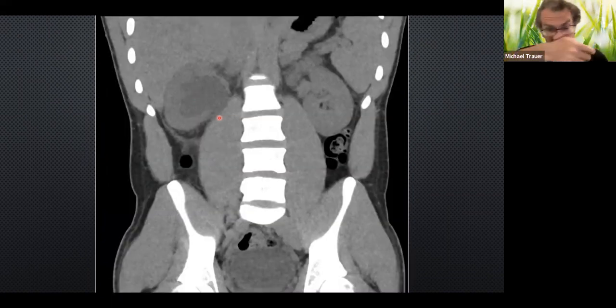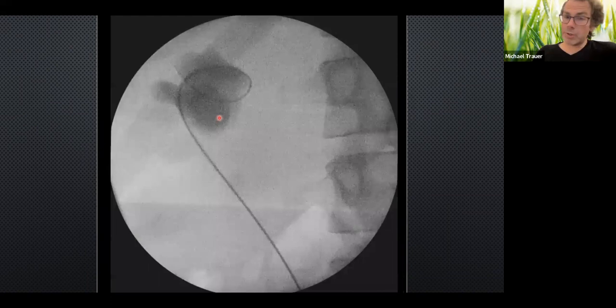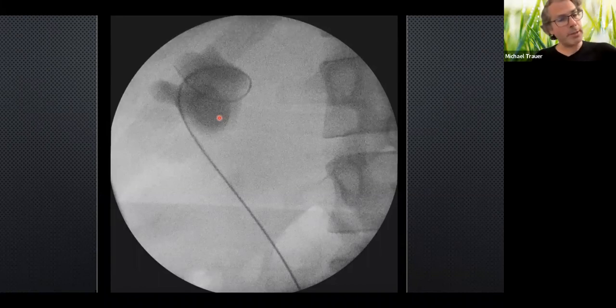So in this case, it was actually a ureteric stricture. The patient was admitted under urology and had a stent placed later that day and did very well. Fever came down the next day, and I think he went home 24 hours later with oral antibiotics. So I think that case demonstrates that PoCUS can have a role in patients with fever without a clear focus of infection.